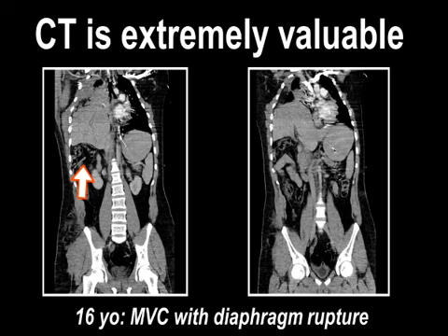The first thing I want to emphasize here, and we've heard a little bit about risk and technologies to control dose, and certainly one of the most pervasive issues with diagnostic imaging is radiation exposure and patient protection, is that we all have to remember that there is a huge benefit with CT, and that should be the overwhelming perspective by which we approach risk. And this is just an example of the benefits of CT.